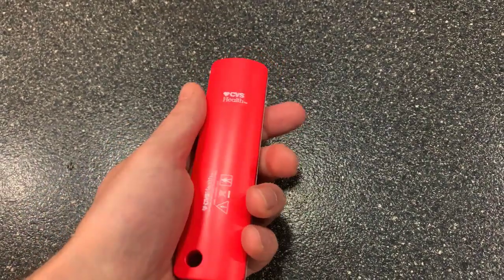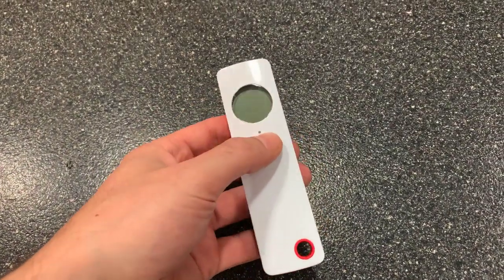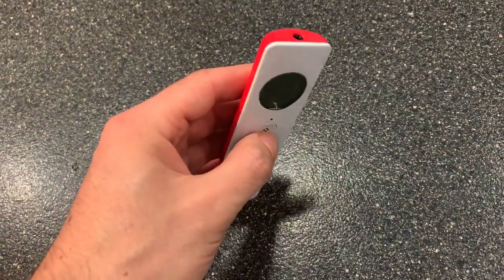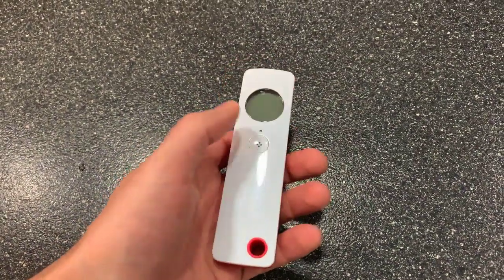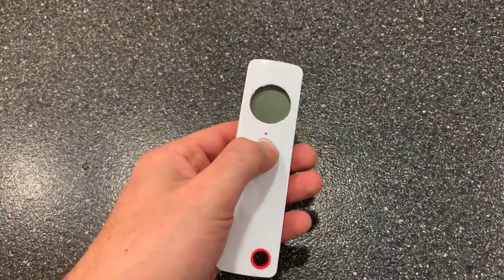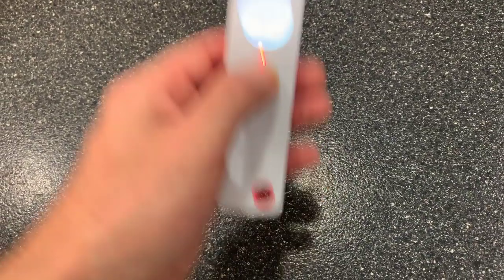I'm not sure how long this technology has been available, but this is a thermometer and it's super simple. There's one button and all you have to do is hold it up to your forehead.